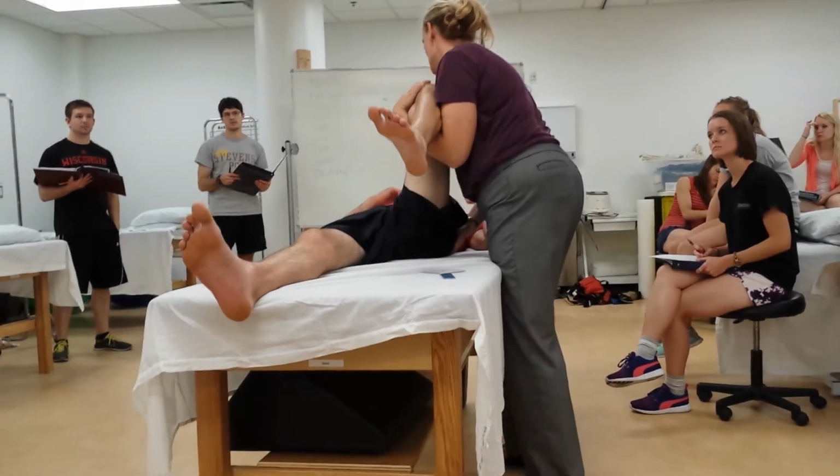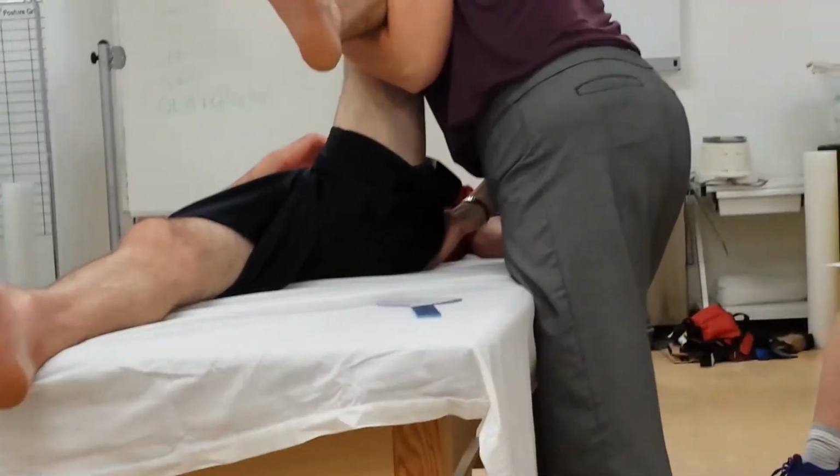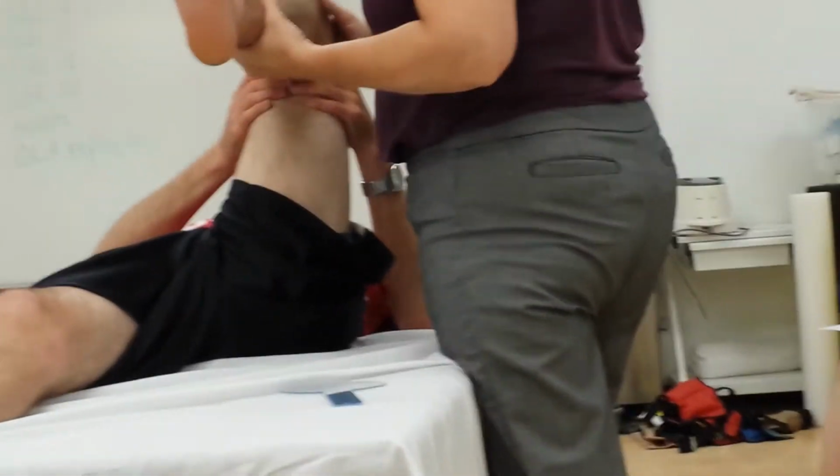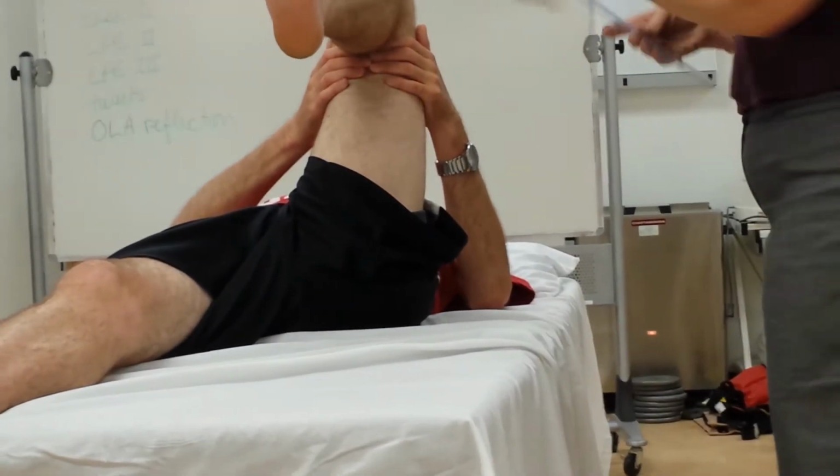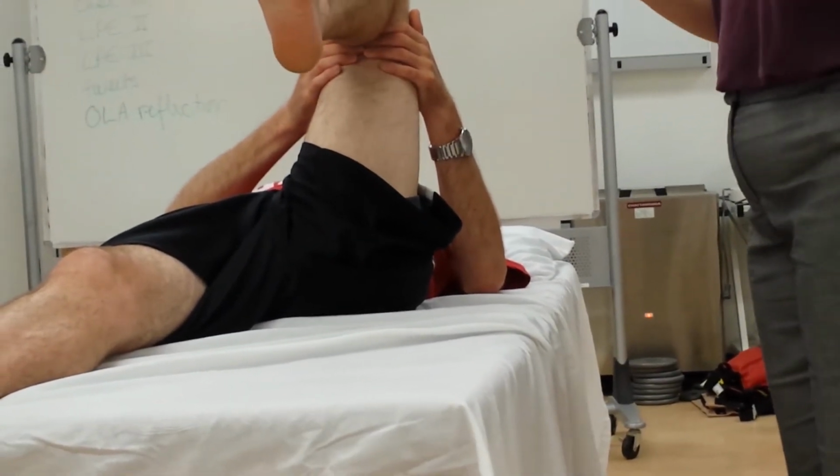When I give more motion, did I stretch you out? Maybe. Okay, can you hold it there for me? There you go. Oh, don't go more. I didn't know it was. Big cheater. So, go ahead and relax your leg. So for goniometry, you can go ahead and put it down.